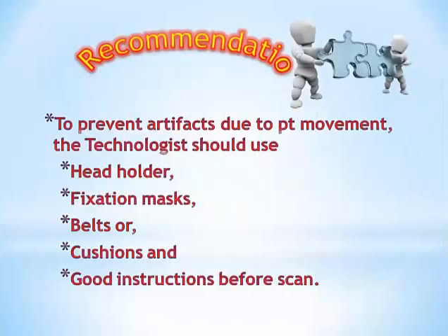So, recommendation, again. To prevent artifacts due to patient movement, the technologist should use head holders, fixation masks, belts, or cushions, and give good instructions before a scan, so you avoid the patient moving their chin a lot during the imaging time.